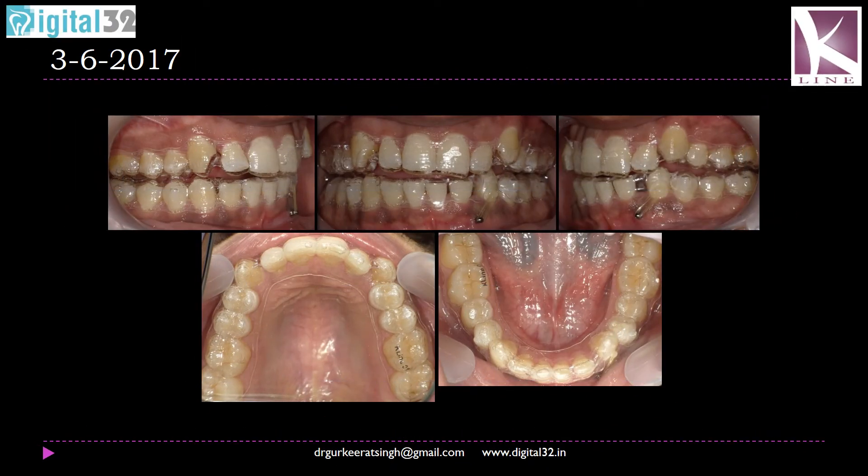We placed a temporary anchorage device mesial to the 3-3, and we made a button on the 3-3 — that is the mandibular left canine — at the gingival one-third. There is a small window in the aligner preventing it from impinging onto the button. The patient wears a small elastic 24 hours — a gray elastic in transparent form in this case — exerting a small amount of force for the intrusion of the mandibular left canine. Once this movement has been achieved and there is enough space to extrude the maxillary left canine, we will form another button.